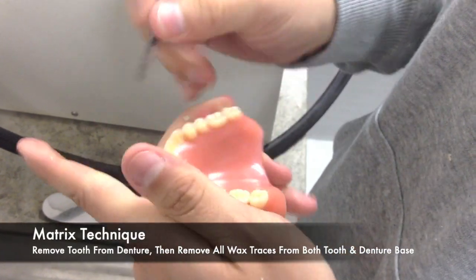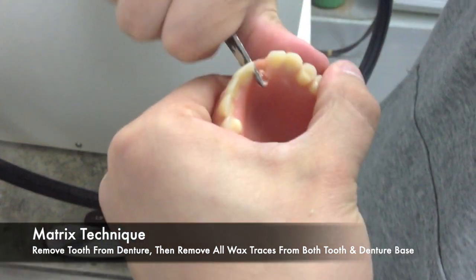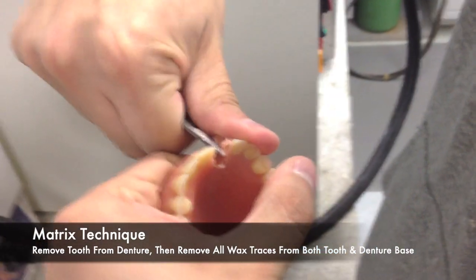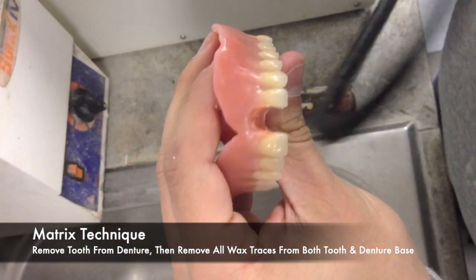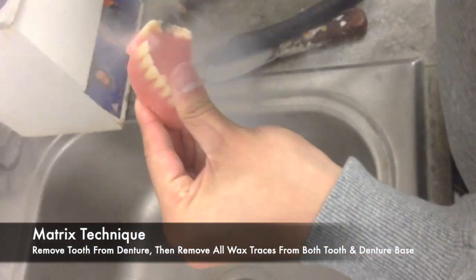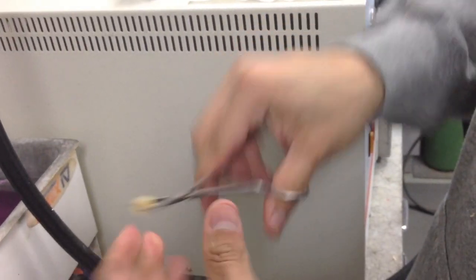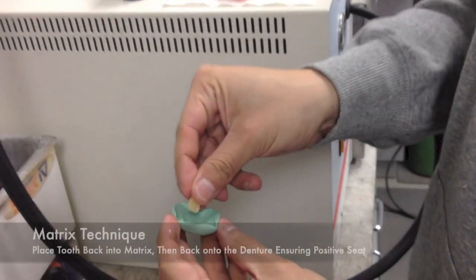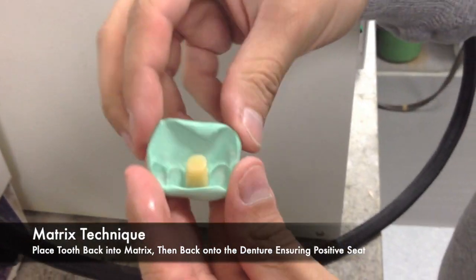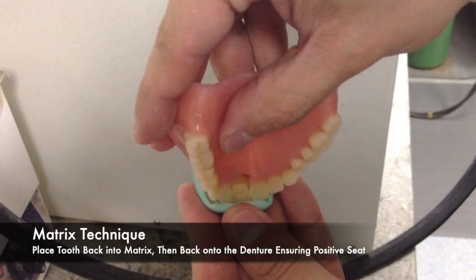Once the matrix is off, you can remove the repaired tooth from the denture and then remove all traces of wax from both the denture base and the tooth itself. You can do so in a boil out tank or with a steamer. Once all traces of wax have been removed, place the tooth back into the matrix and then back onto the denture, ensuring a positive seat.